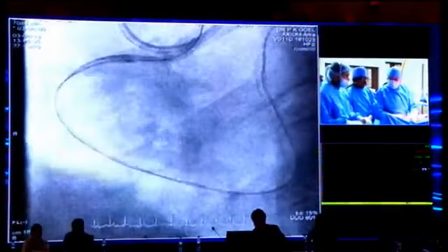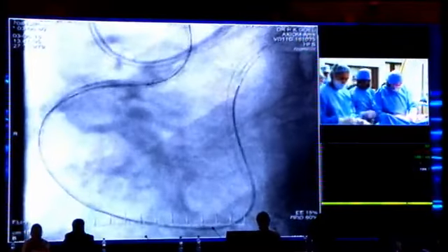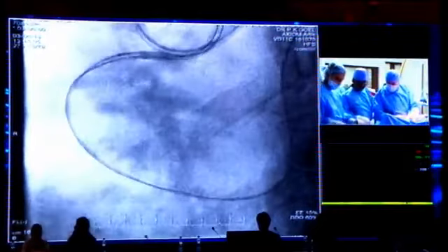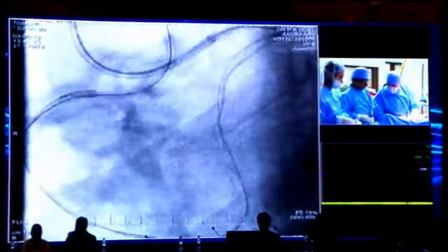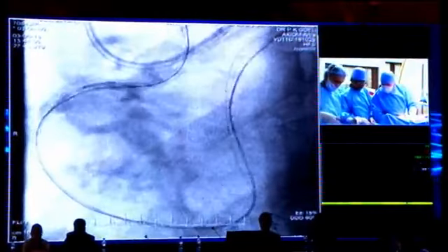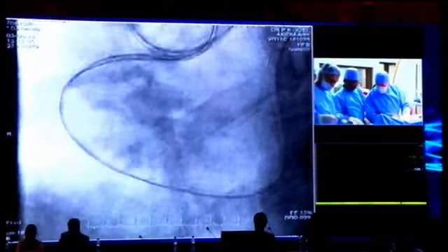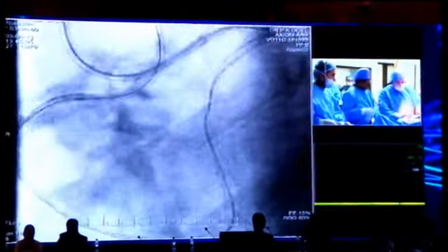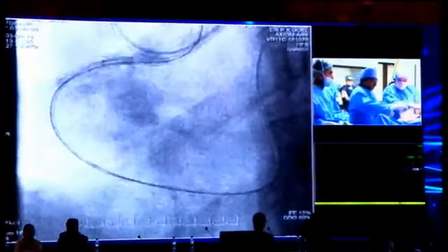And now we just have to wait until it comes out from the other side. We need to open up there, but only when we are close. After having done a number of retrogrades, you know when the RG3 is coming. We have long catheters. I would prefer, of course, for retrograde to do it with short catheters.